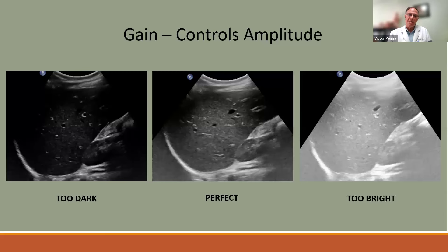Gain control is the other critical adjustment. It makes the difference between a really dark image, a perfect image, and something too bright. As with the isoechoic lesion example, you can miss findings if gain is too dark or too bright. The goal is homogeneous brightness from top to bottom. Depth and overall gain are the two truly critical controls.